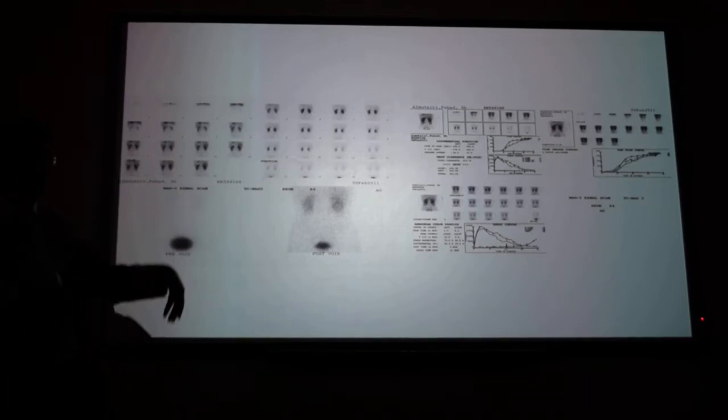Doctor, if DMSA is only anatomical, why is it considered nuclear medicine? In some cases where we suspect chronic infection resulting in kidney loss like scarring, we do DMSA. If we are concerned about the excretory function, whether there is hydronephrosis, whether the kidney is properly excreting contrast, then we do DTPA.